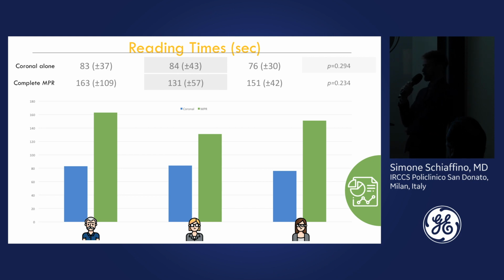But the assessment was complete. We have to consider that these readers are experts. They perform breast ultrasound, and they are all sonologists that do only breast imaging in their clinical daily practice. And did you make a separate analysis for the negative cases versus the positive cases? Yes, in the paper we did that, and the difference is not statistically significant. They're quite the same. And that time is for the 6 views? Yes, 6 or more.